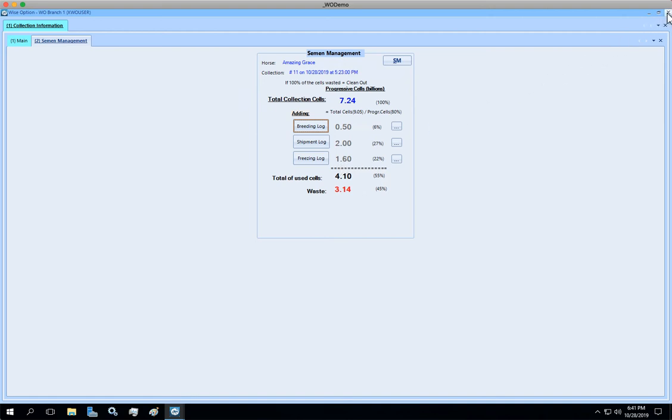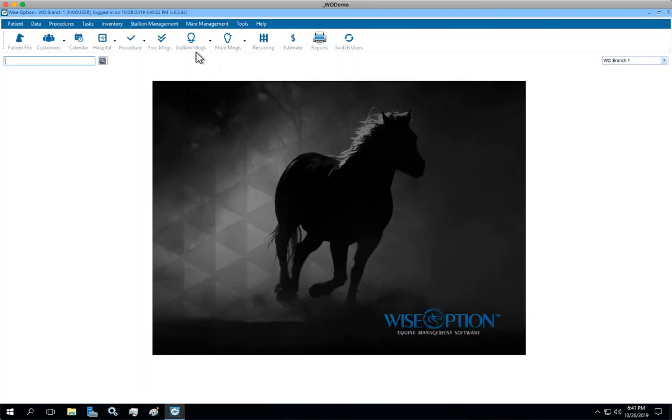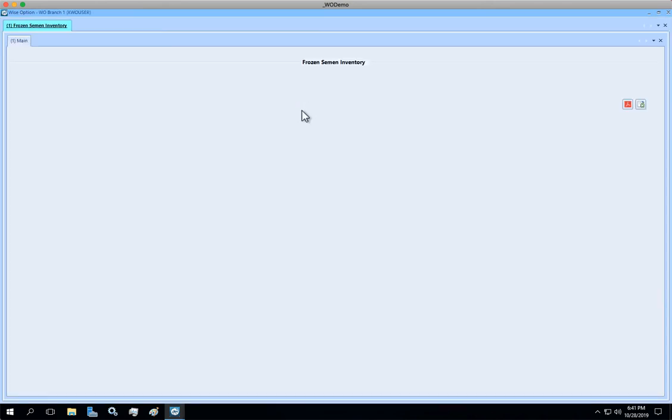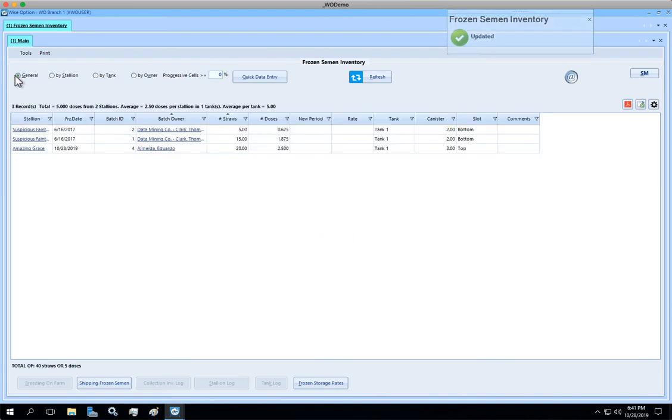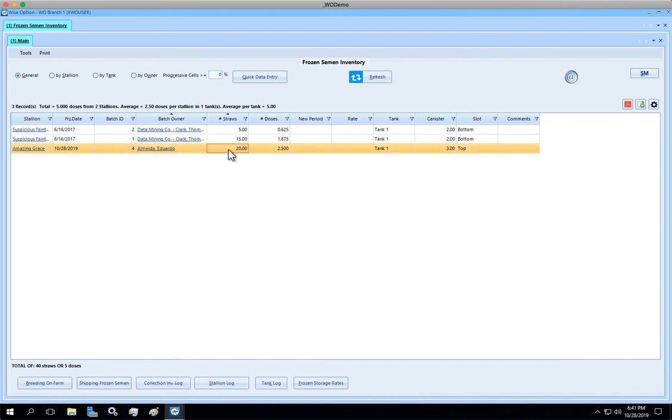And if I go now to my frozen semen inventory, and I click on General, you're going to find my 20 straws from that freezing process.